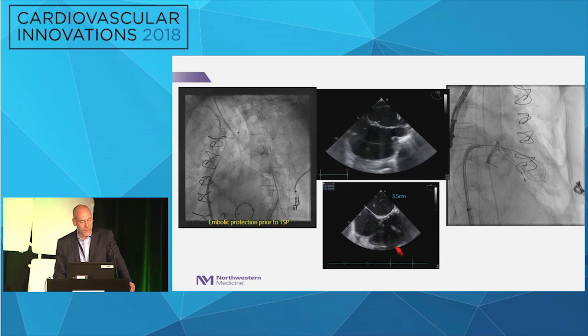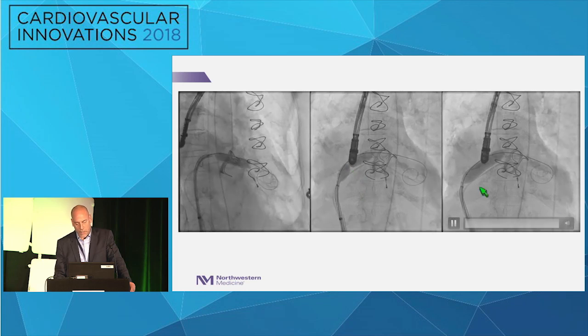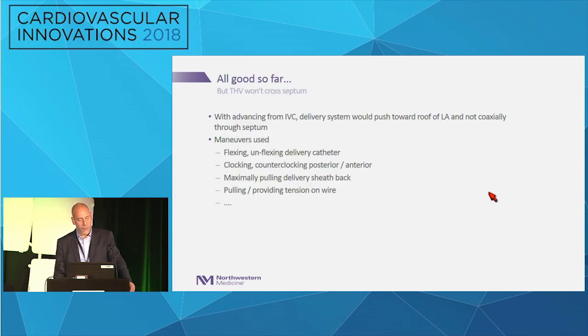It looked like we were about 3.5 centimeters away from the valve where our puncture was at this time, so we went ahead and did that. And then we got what I thought was a pretty good looking angle into that LV through the mitral valve. Looks like a nice, easy sort of shot through there. We balloon the mitral valve. We don't always do this. We balloon the septum twice. You see a little waist here and then no waist there. Soon after this, we just did a quick floss through.